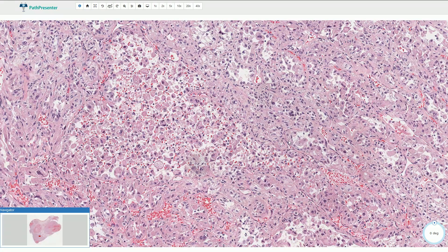Most of these tumors have some proximity to skeletal muscles, and it has been hypothesized that skeletal muscle is the cell of origin for this tumor.